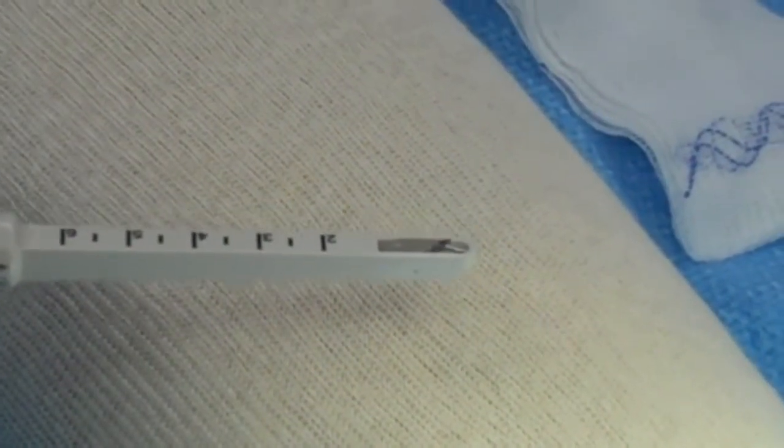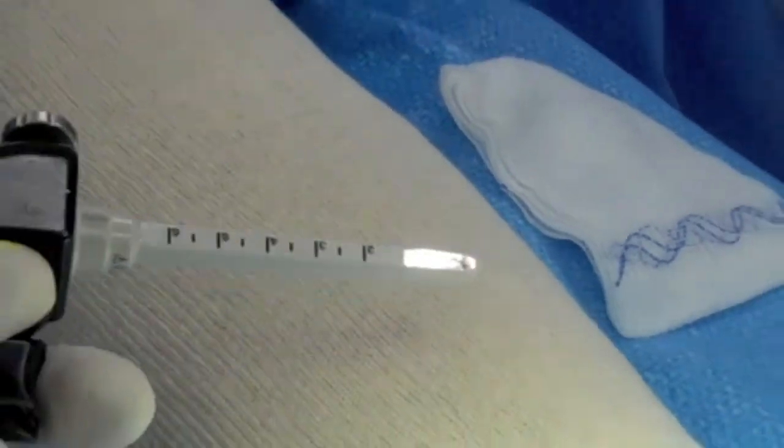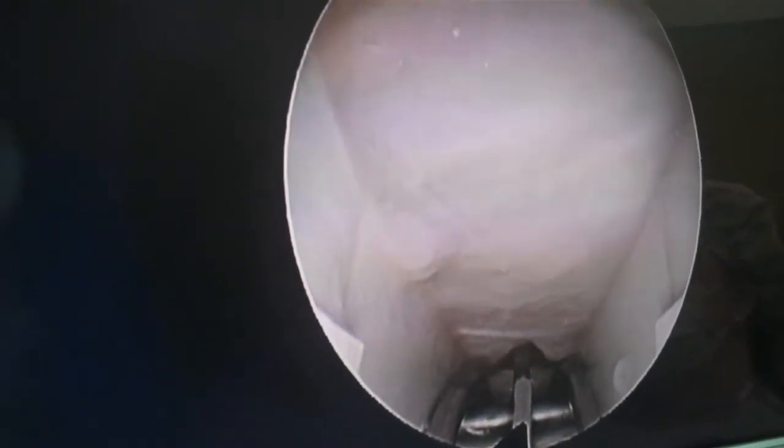If you look closely here, you can see me raising the tiny blade back and forth outside the body, and here within the carpal tunnel. The surgeon has fantastic vision on a large screen or monitor, as you can see here, and can release the tight band which causes carpal tunnel syndrome under this magnified view.